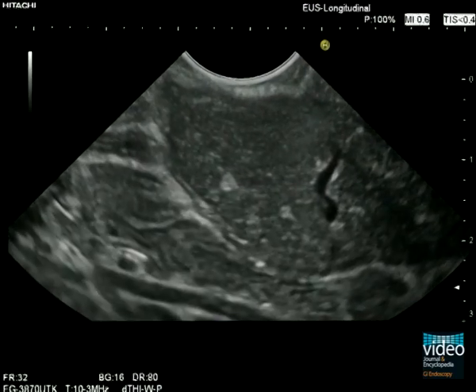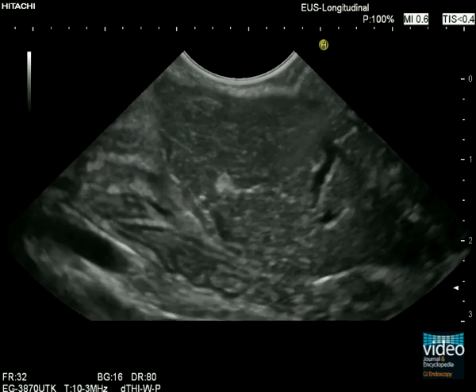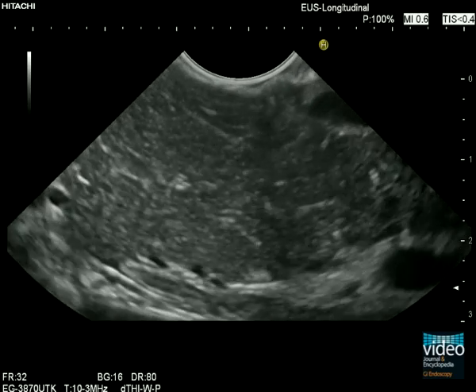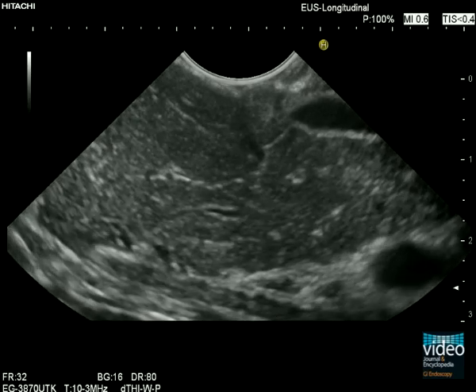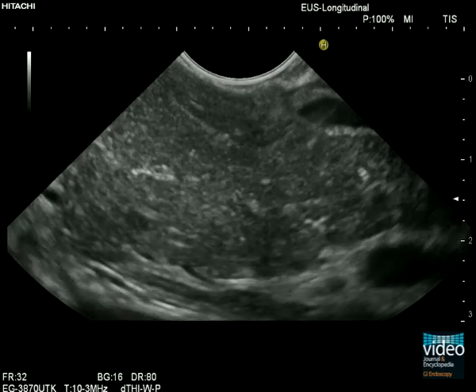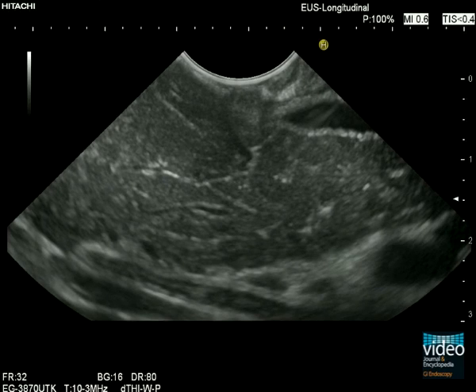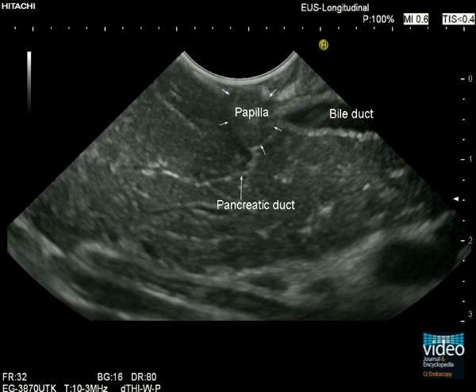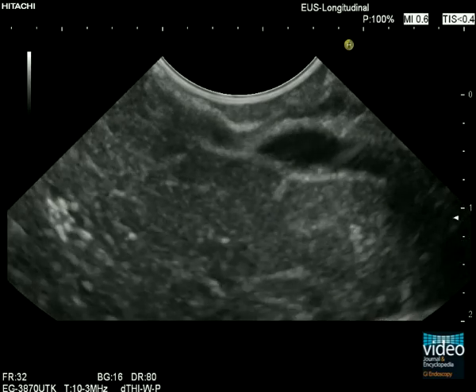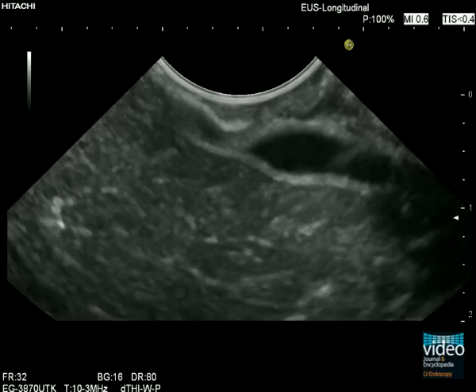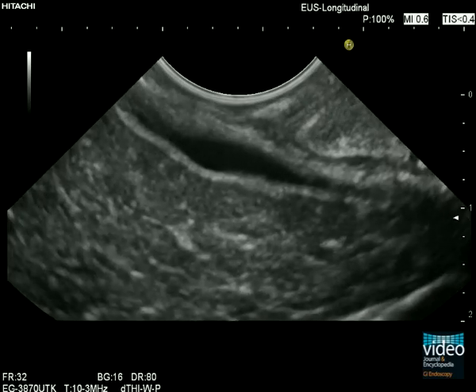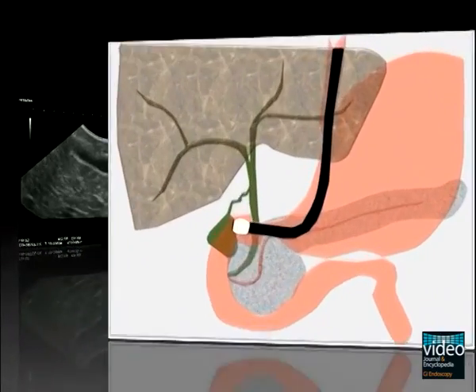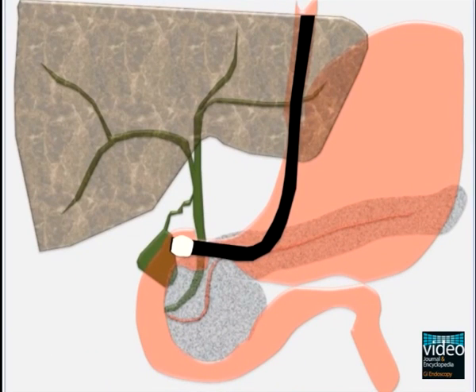In this third example case, the slim pancreatic duct branches near the slender oval papilla. We follow the course of the bile duct by pulling the scope while slightly moving it counterclockwise. At the right-hand side of the screen, we see the transducer retracting past the pyloric sphincter. Therefore, the transducer is now in the duodenal bulb, visualizing the more central part of the common bile duct.